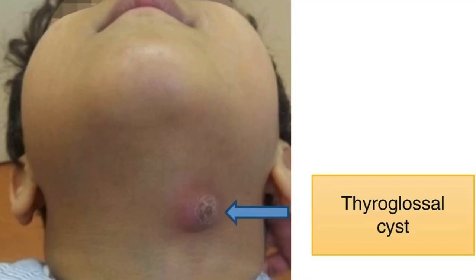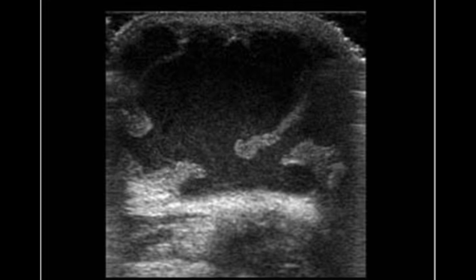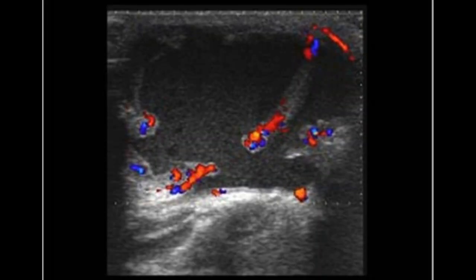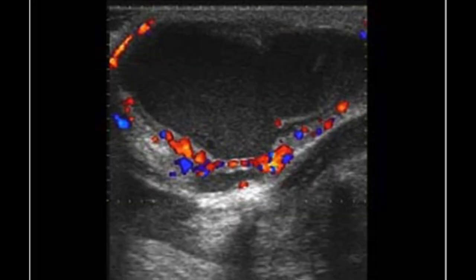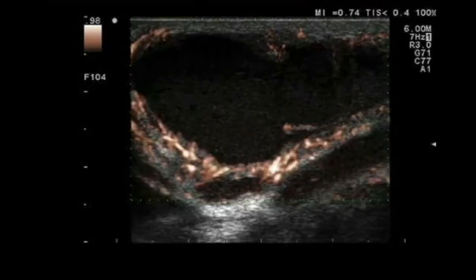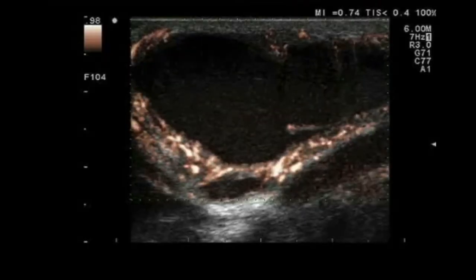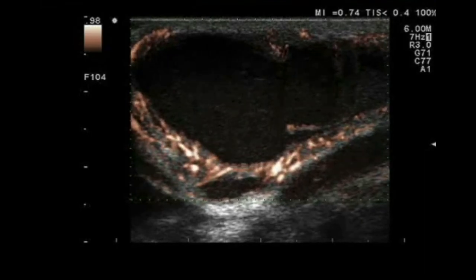Complications of a thyroglossal duct cyst are usually infection, and you can also have recurrence after surgical resection. Infected thyroglossal duct cysts will oftentimes have internal debris and peripheral inflammatory changes of the surrounding soft tissues, such as fat stranding, free fluid, and hyperemia.